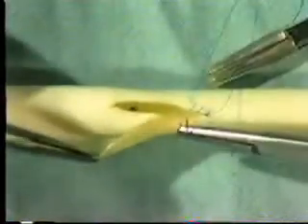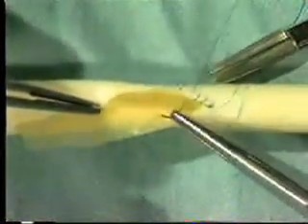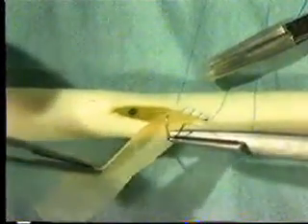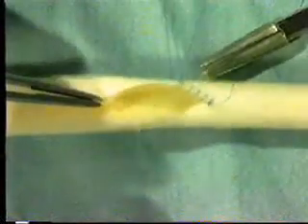Continue to work down the far side of the incision, only going through both graft and artery with one sweep when it is very apparent that it is safe to do so. In normal circumstances, however, it is inadvisable to suture both vein patch and arterial wall with a single traverse of the needle unless you are extremely experienced.